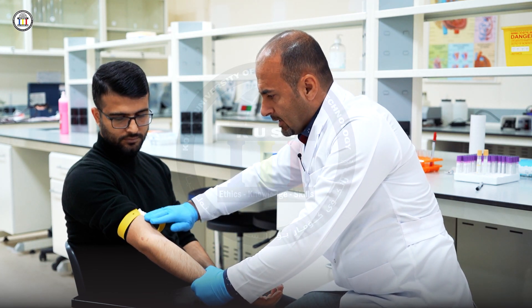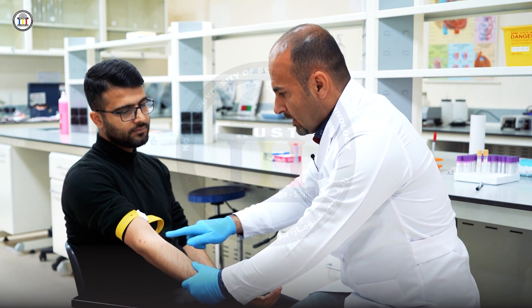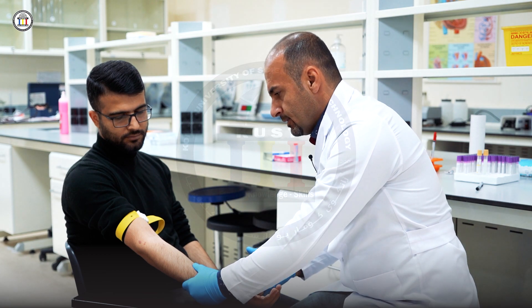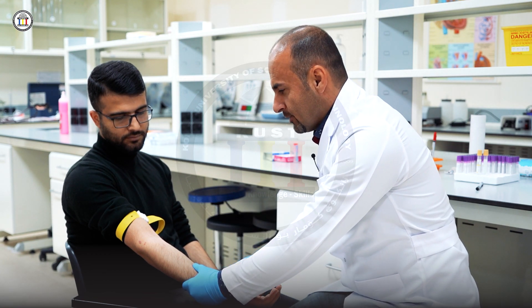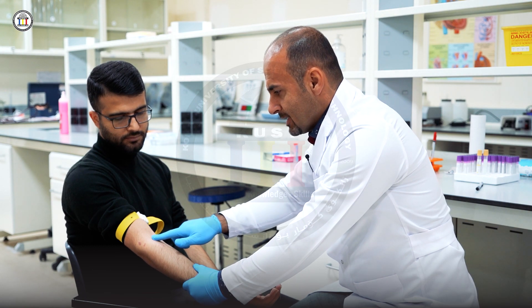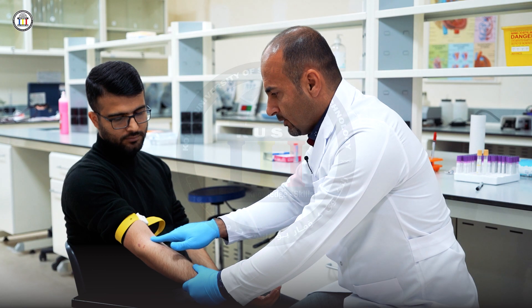We're going to start by applying the tourniquet. Be careful about the location — it should be nearly above the puncture site, about four fingers. After that, you are going to check for the presence of the vein. You can see it if you are lucky, but most of the time you have to feel it by a technique known as palpation. After finding a suitable vein, you can start cleaning.